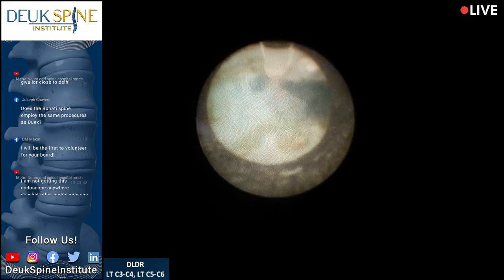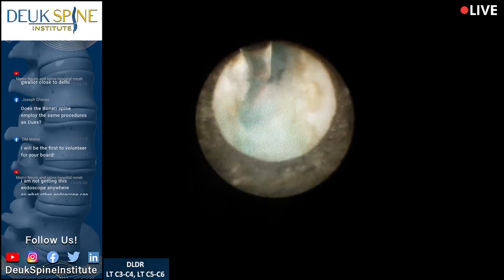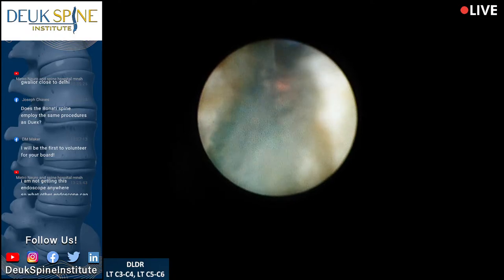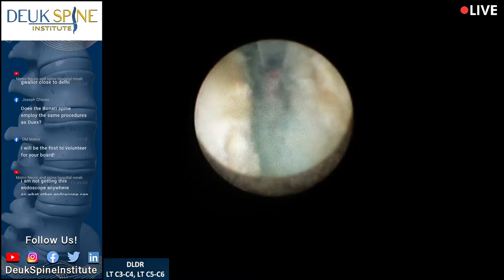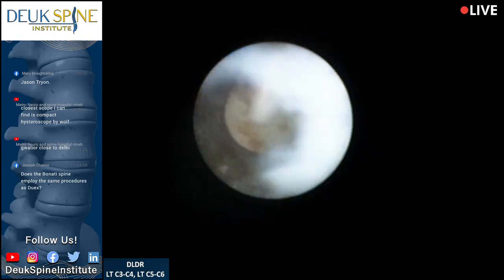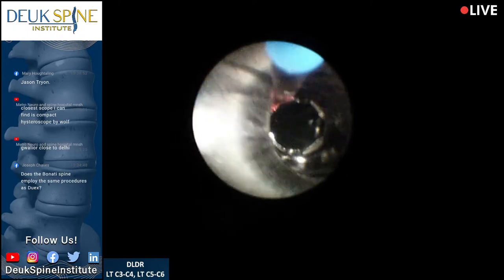I really would love for you to have the right equipment, Doctor — it makes all the difference in the world. I won't even do surgery unless I know I have the best equipment available. We are done. You can see where the herniation was and on the other side it's gone. There's just a little bit of foramen ligament there. What you may not be seeing is the irrigation going on inside the tube — but you can see things floating around because there's irrigation constantly cycling in and out.